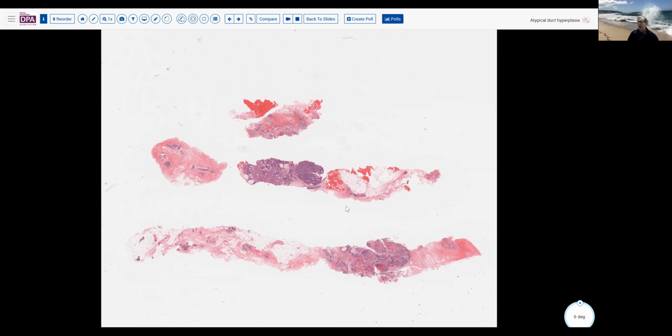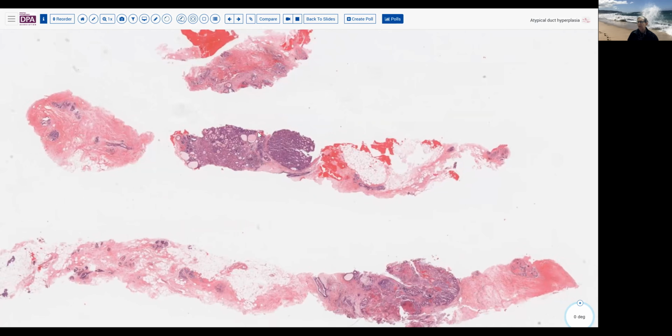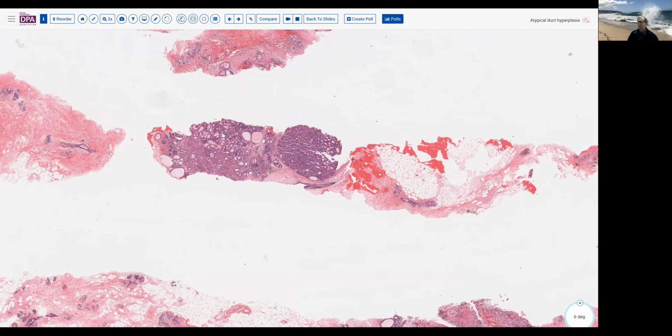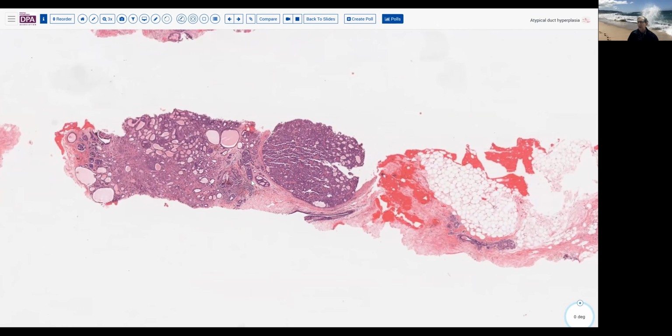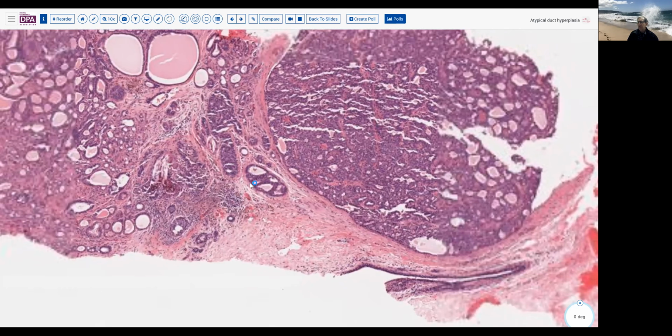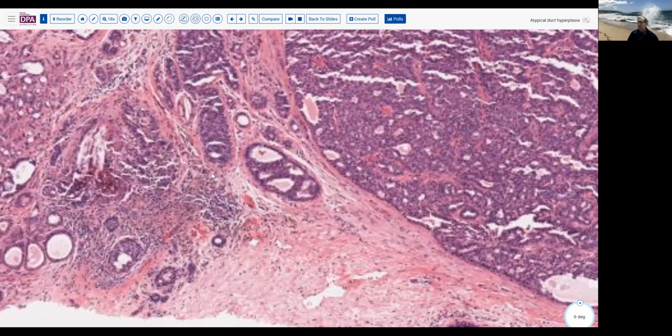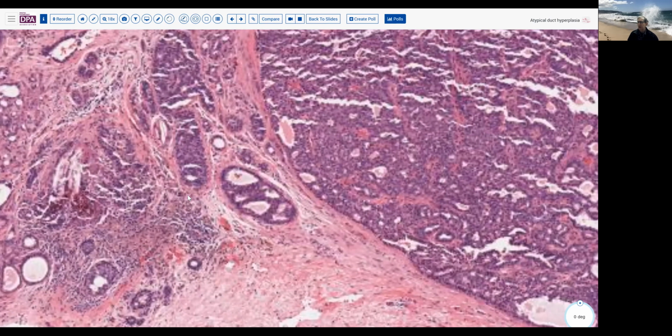So what are the boundaries? Well, I put this case in to compare. Again, this looks like a kind of busy structure. We have a more solid area here, and we have a few enlarged ductal spaces here, and one here that begins to look like a sort of cribriform carcinoma.